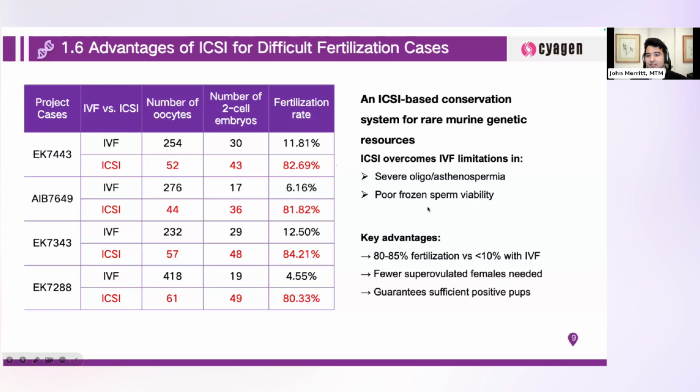In terms of resources, it's cheaper to do IVF because essentially you're just putting sperm in an egg in a petri dish. But we get better results, better outcomes with ICSI. So that's something to consider.